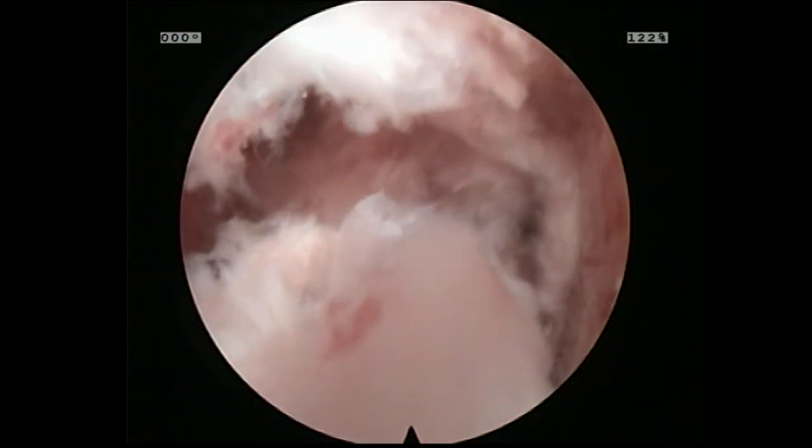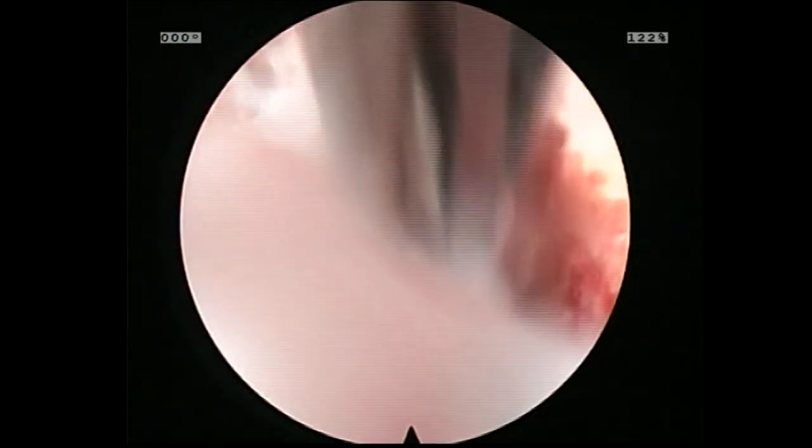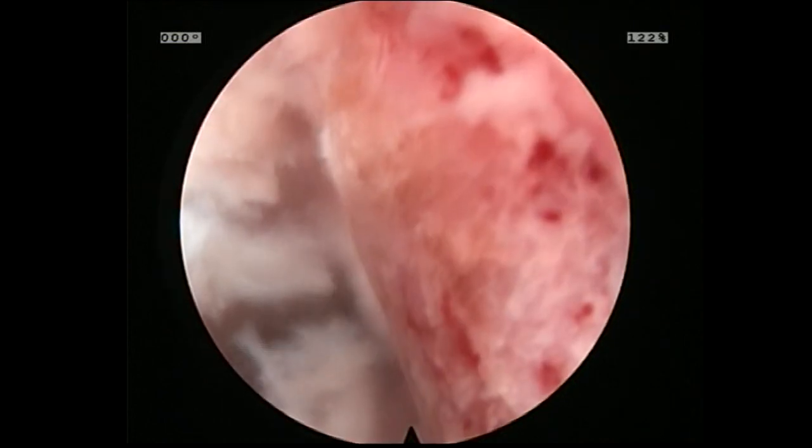Here I am just working the end plate, removing disc material. Obviously we've done a much better job. I'll go in here and remove some of the loose fragments with the pituitary, but already you can see what a tremendous improvement over what I already thought was a good disc space prep.